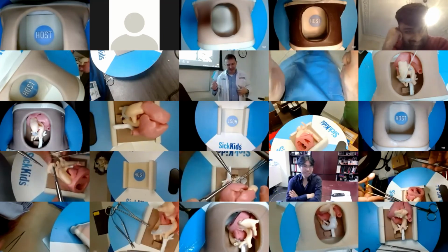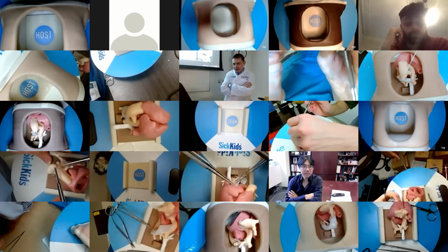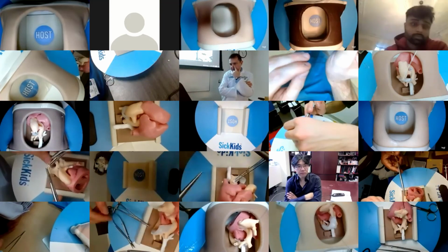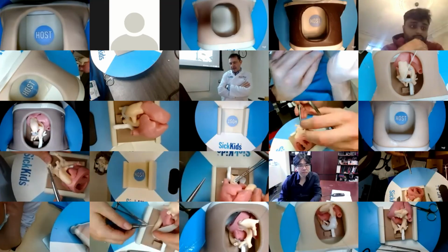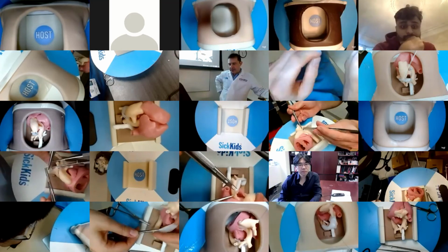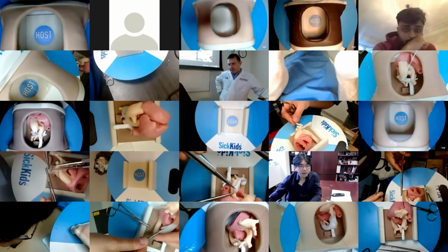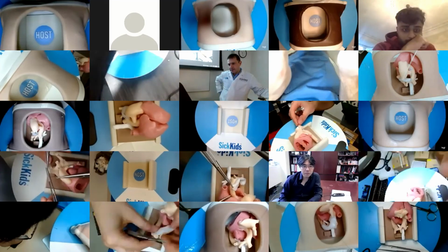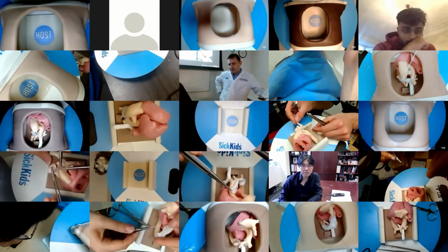Perfect. Beautiful demonstration. It is nice, in a way, that it gives you a large volume and size to the arch distally. But the trick is judging that patch. I think the way you show it, where you trim it and shape it as you go, is a way to do it. Yeah, I think it's almost impossible to pre-make the patch shape.